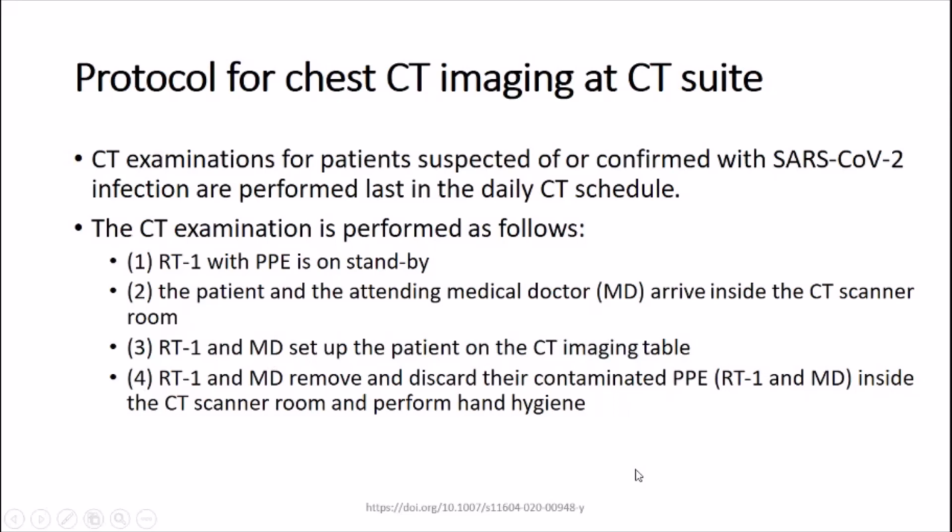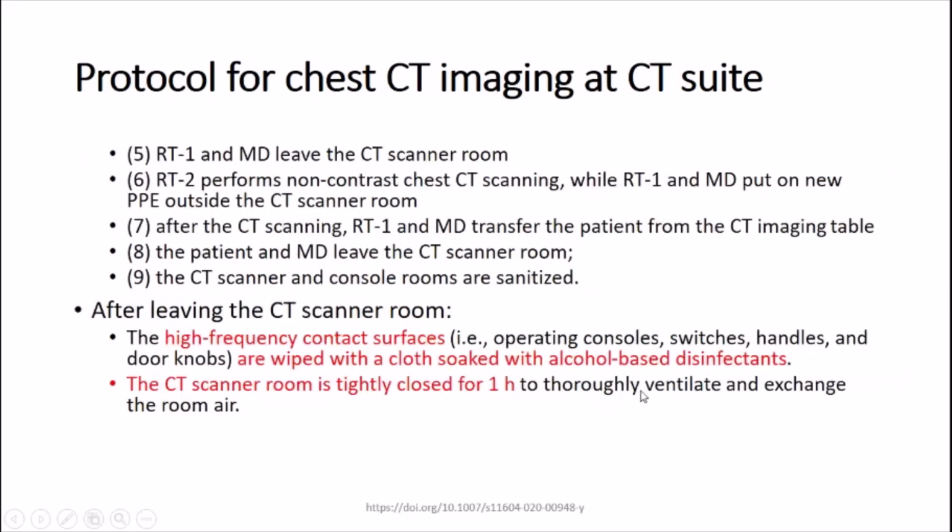Technologist number one and the MD will remove and discard their contaminated PPE inside the CT scanner room, perform hand hygiene, and leave the room.